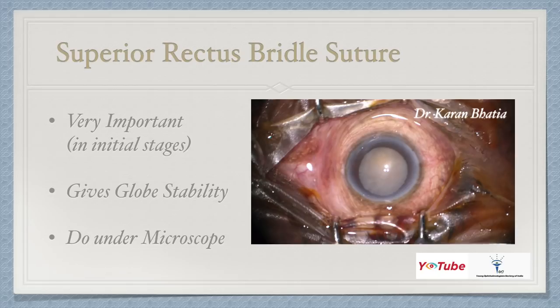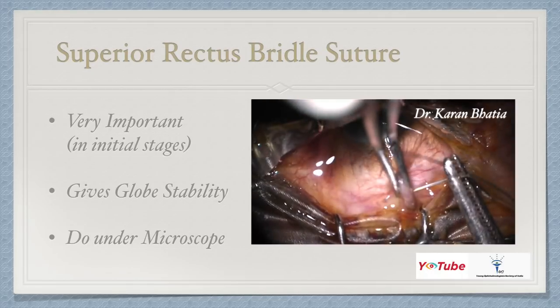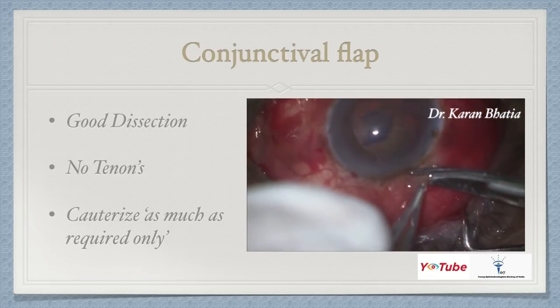The first step in SICS is a superior rectus bridle suture. It is very important especially in the initial stages as it gives good globe stability, and one should always operate under a microscope. Using superior rectus forceps, you can easily hold the superior rectus and pass the bridle suture underneath it. Wait for the needle and thread to come out before releasing the forceps. Initially, always do all your cases using a superior rectus bridle suture.